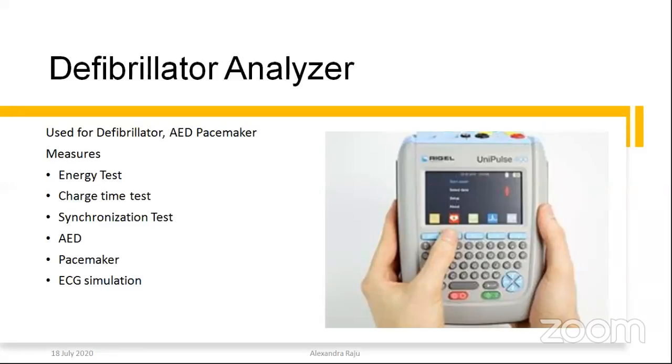So this is a kind of defibrillator analyzer, an analyzer which can test the energy test, charge time test, synchronization test, and AED, pacemaker, ECG simulations can be done with the help of the defibrillator analyzer. So we know that the defibrillator delivers energy. So we have to measure the charge time, how much time the equipment is taking to charge.